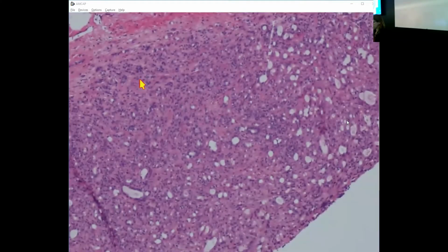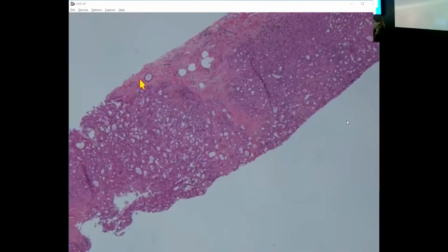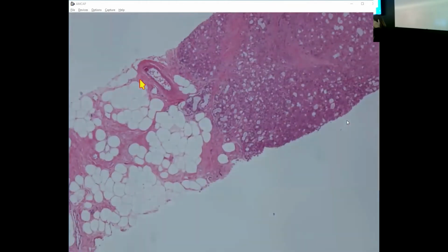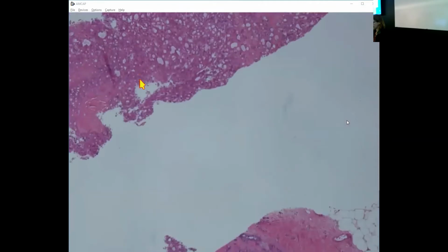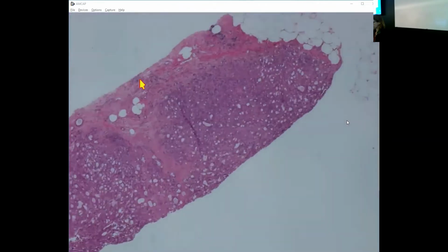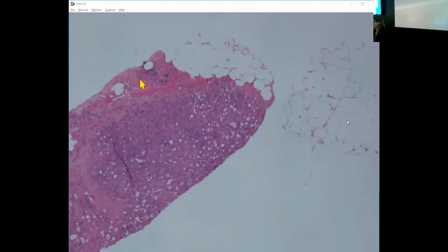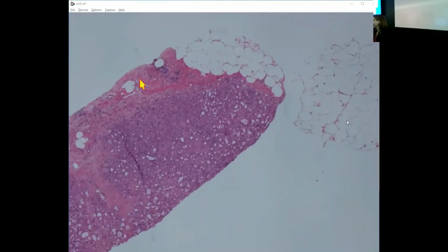Okay, this is a core needle biopsy in a patient who, let's say, is perimenopausal. Does anybody want to try this? And this one's not easy. There was a differential diagnostic dilemma here. But if we started at this end, what are people thinking? Pink. Who wants to speak about this case? It's very pink. I agree.